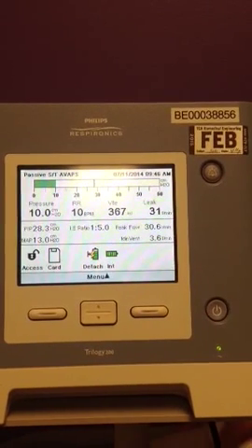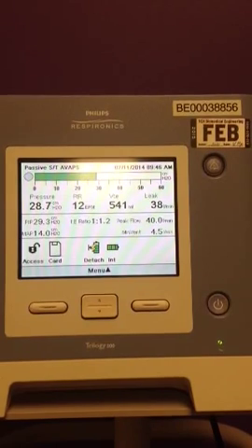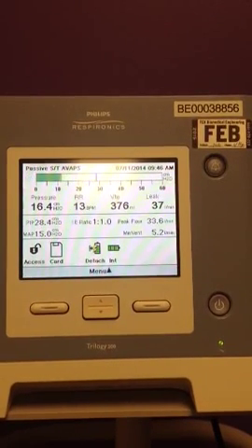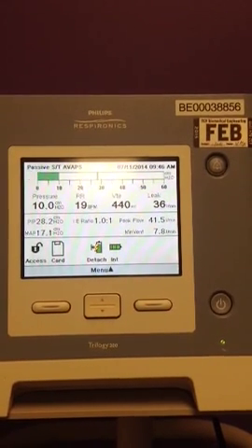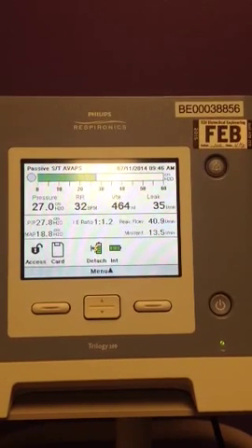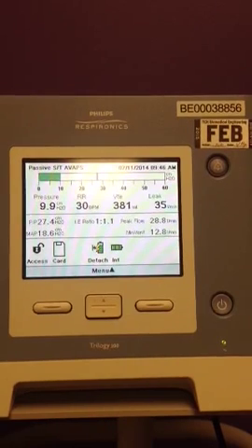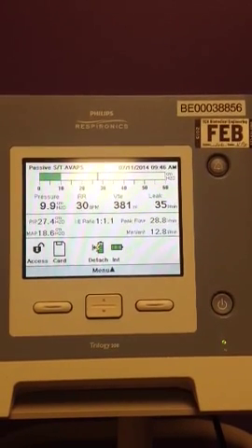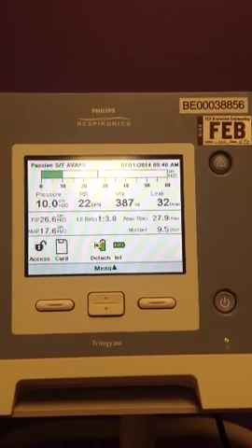You can tell when the patient takes a breath because a green dot appears right beside the pressure diode. That green dot appears every time the ventilator senses a patient-triggered breath. So then again, if the patient stops breathing and the time has elapsed for the backup rate, then it will kick in.